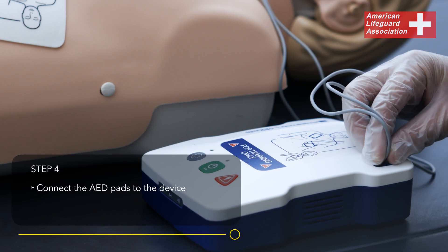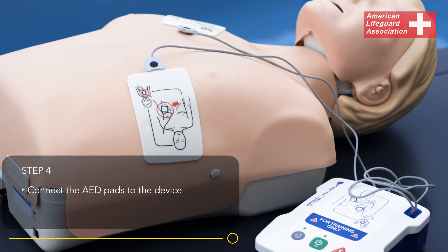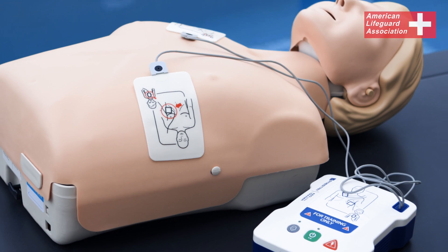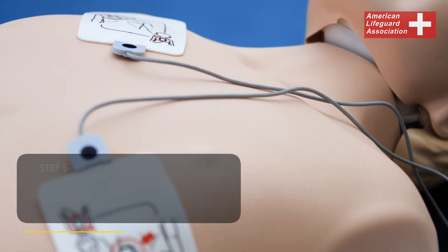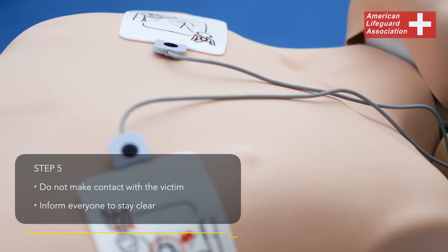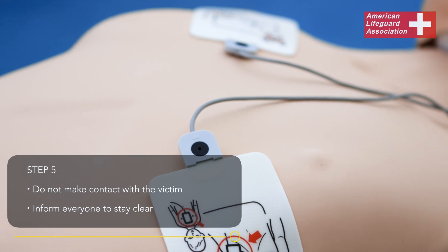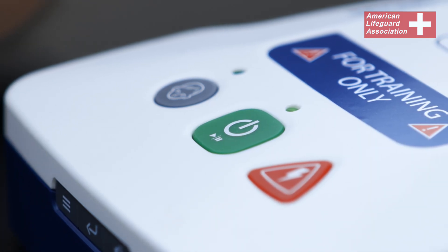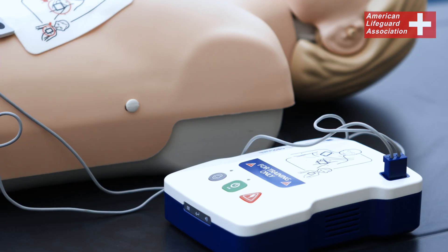Connect the AED pads to the device once they are securely attached to the victim's chest. Make sure you're not in contact with the victim. Verbally declare, 'I am clear. Everyone stay clear,' to prevent interference during the AED analysis.